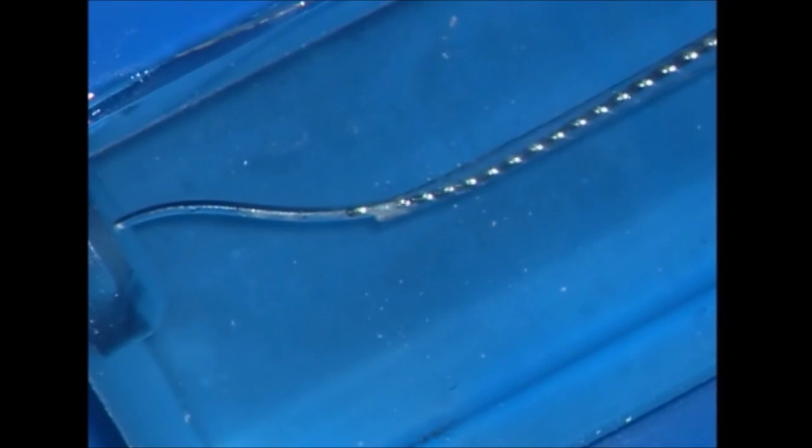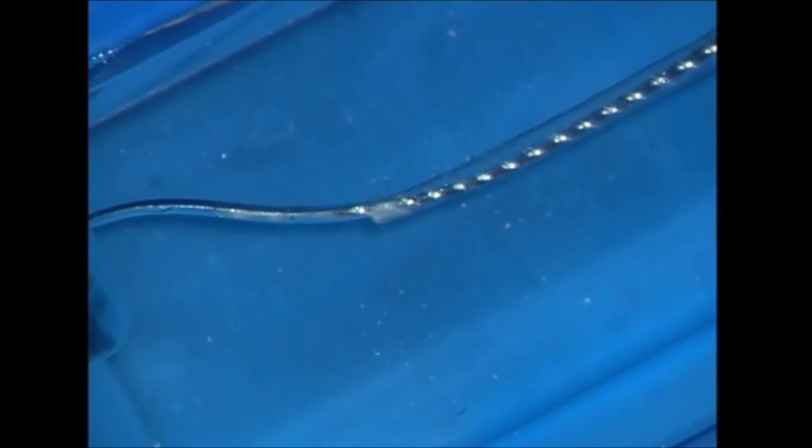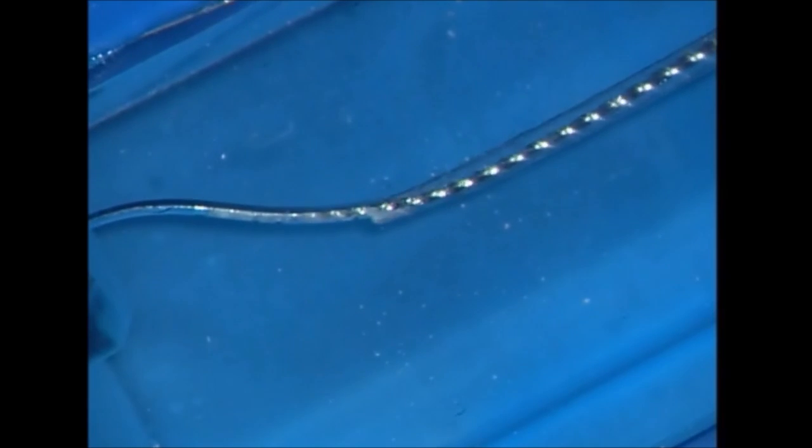It's orientated so that it moves past the ledge and a little bit deeper into the canal. I want to emphasize the importance of taking short little strokes when the file is apical to the ledge so that we can smooth and refine this region of the canal. Remember to work in a fluid-filled canal. Again, the pre-curved small hand file more predictably now bypasses the ledge, works deeper into the canal, and continually refines and expands the glide path.